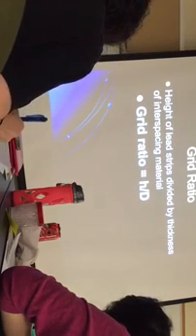And let me say one thing. It's important to understand grid ratio because it will tell you the ability of the grid to clean out the scatter radiation. Let me say it again. The grid ratio is going to tell you the ability of the grid to clean out the scatter radiation. The higher the ratio, the more cleanup it can do. This is an important fact. If you look at any grid, doesn't matter what type of grid, on the back of any grid, unless they rip it, this is one of the things that is going to be shown to you.